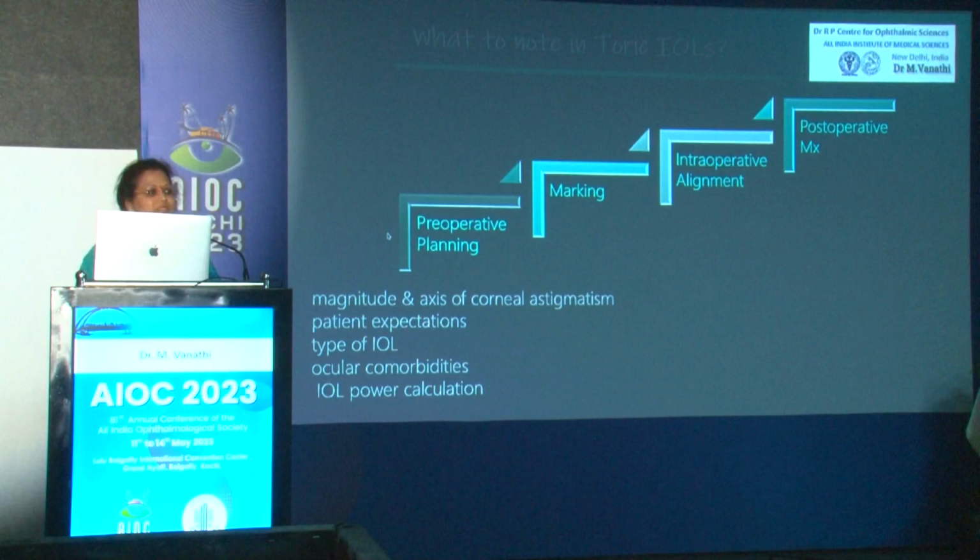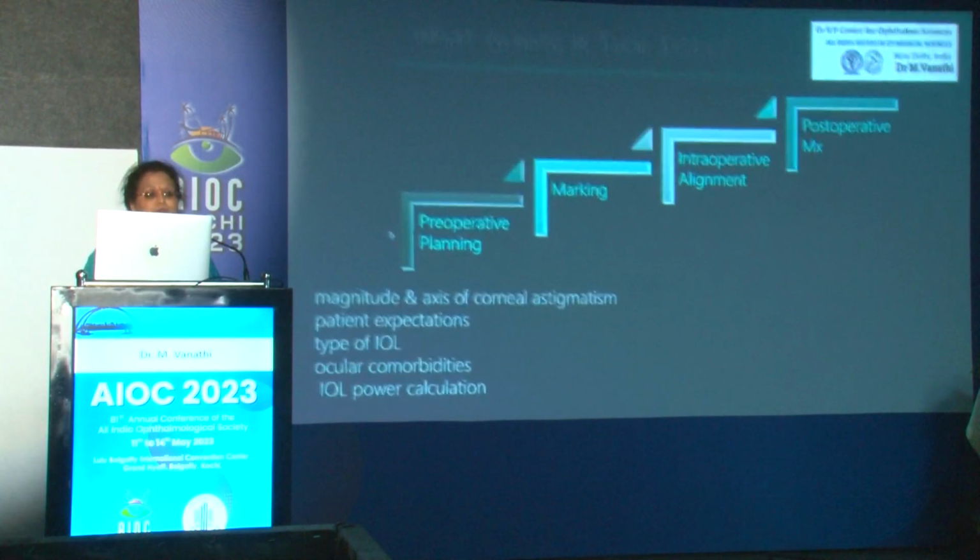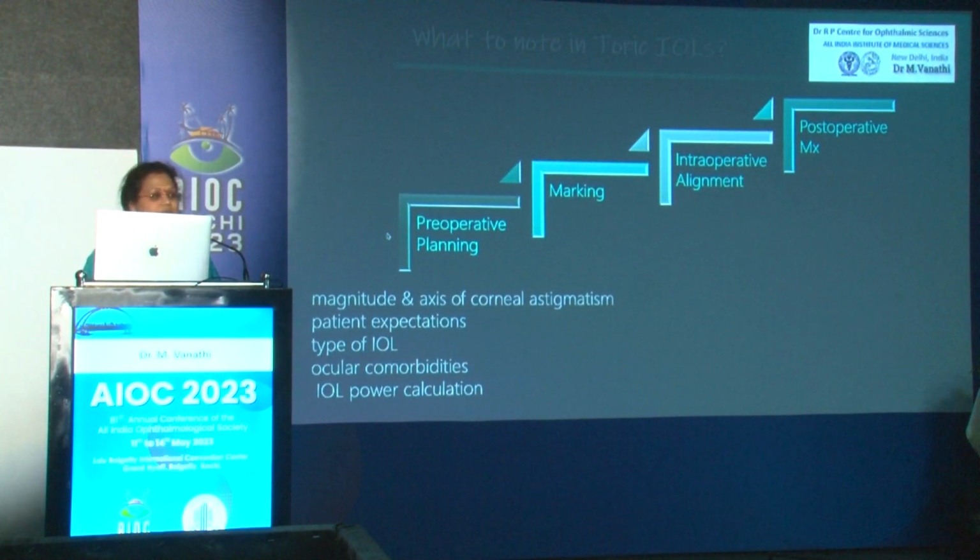Again, what are the important steps you need to place importance on is your preoperative planning, the way you adopt marking, the intraoperative alignment here, and the postoperative management of cases which have surprises here. So this is largely how you would go about, and this is what you need to look at when you're approaching or when you want to refine your toric practice here.